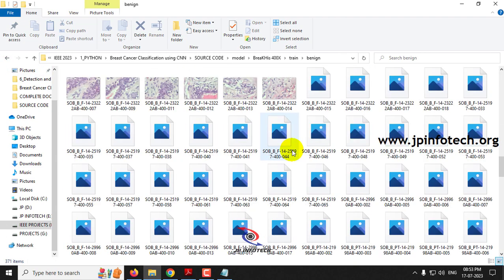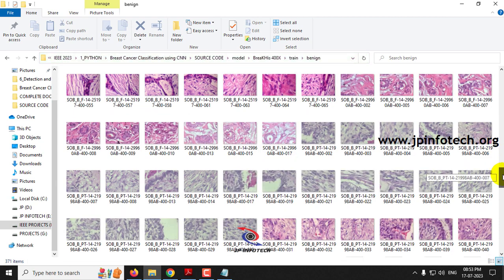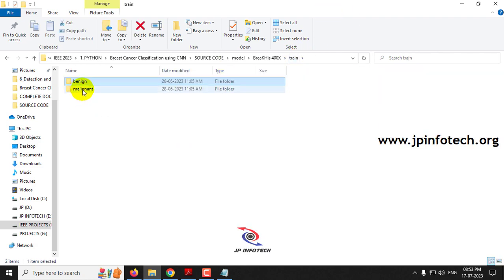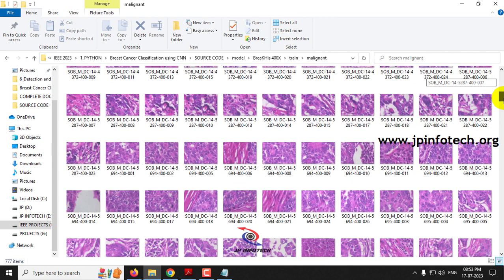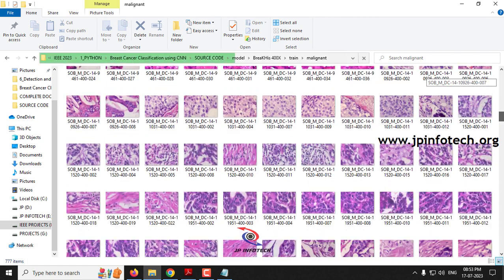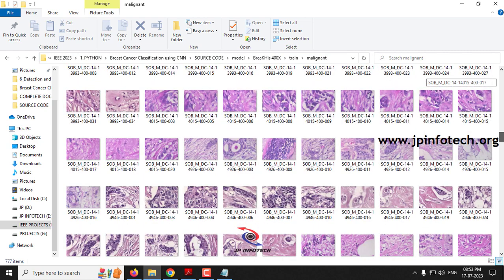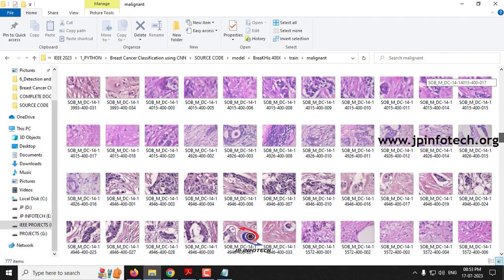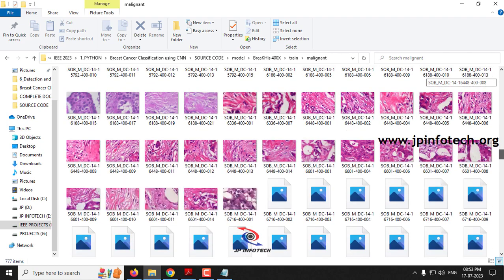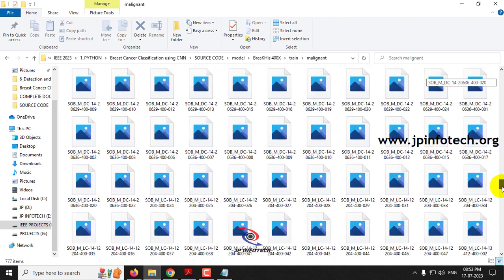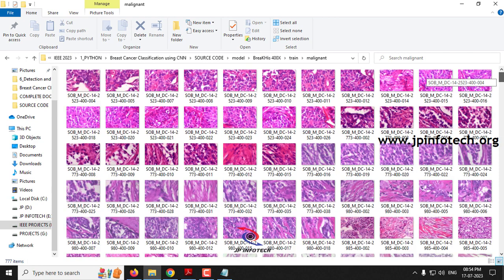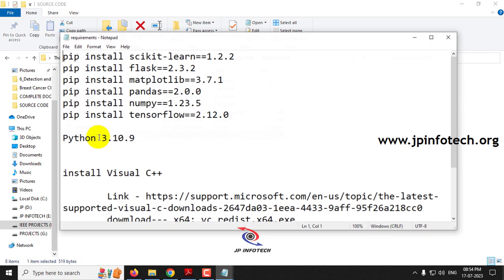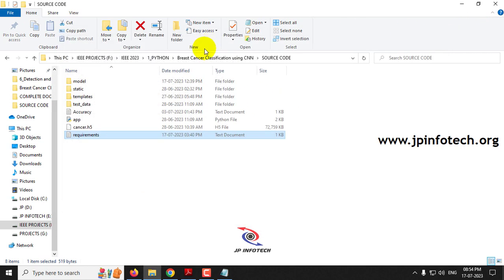These are the images trained in the system containing class benign and malignant. In the existing system, many people used machine learning models with tabular input such as area and perimeter values rather than images. In deep learning, fewer works have been developed on this. Before execution, make sure you have fulfilled the requirements mentioned in the requirements file, with the exact version of Python and libraries installed on your system.